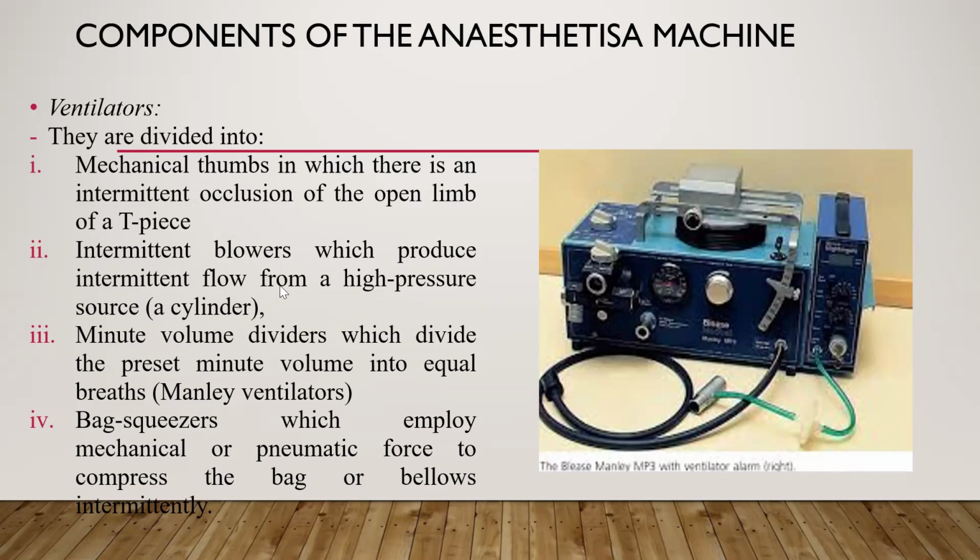All right. So there are different ventilators. You remember that we said that some of the functions of an anesthetic machine is to be able to ventilate the patient. Oh my God, a lot of people say we have never seen it before. Okay, am I that old now? I can't believe this.